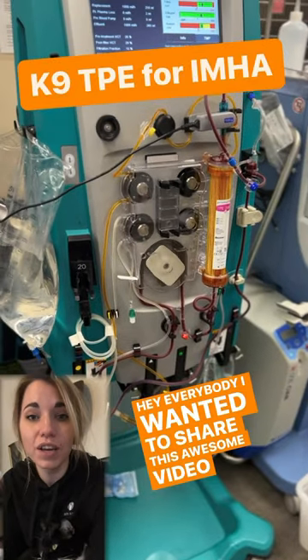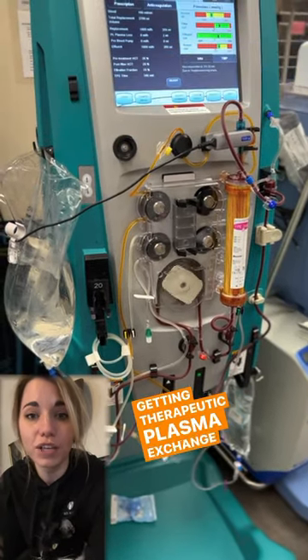Hey everybody! I wanted to share this awesome video of a dog getting therapeutic plasma exchange for IMHA.